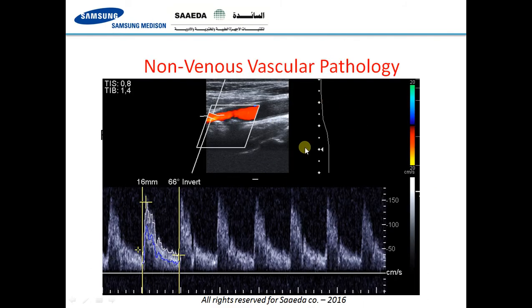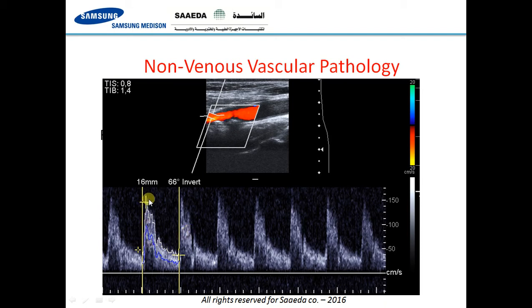Now let's talk about the non-venous vascular pathologies. The most important is arterial atherosclerotic disease. This is a really long subject, but here is an example of a thrombus filling the lumen of the artery, resulting in narrowing and elevated blood velocity — almost 150 centimeters per second. This obviously requires some sort of intervention, whether by stenting, medical treatment, or other means, and would need a full explanation in a separate seminar.